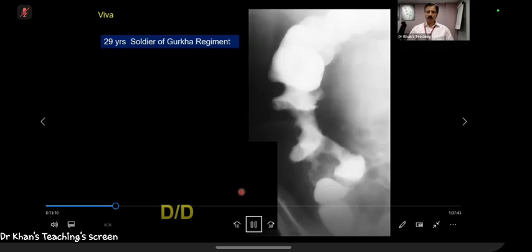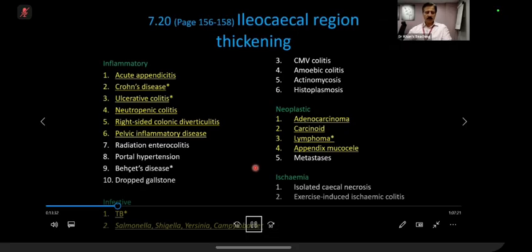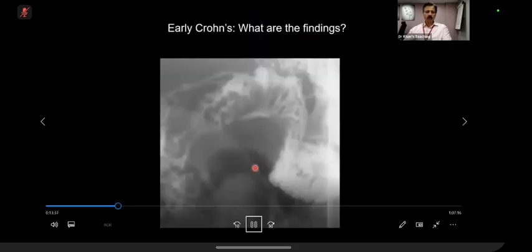It can mimic, by the way. That's number one point to remember. But otherwise, necrotic nodes, more fistula, things like that. You might get with this a TB. You might get X-ray film as a long case and things like that. So ileocecal TB in UK is rare. Crohn's disease is very common. Having said that, you have to keep both of them in your differential.